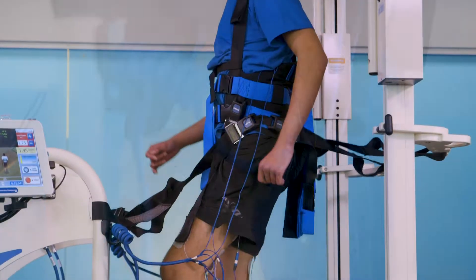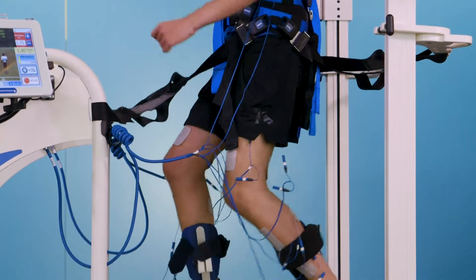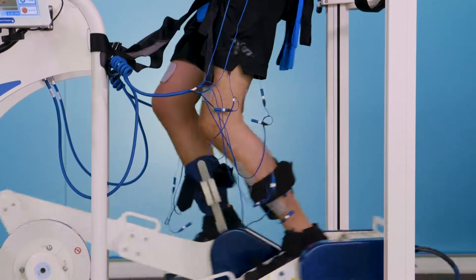Patients with the ability to move their own limbs will benefit from the assistance and added strength of contraction from the electrical stimulation.